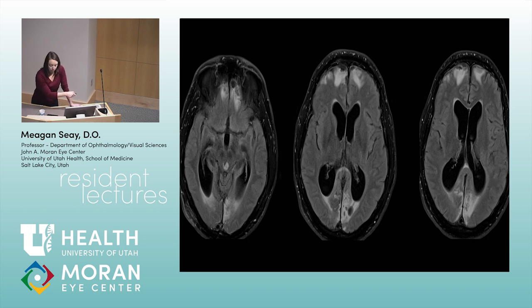Just to briefly review, the most posterior part of the occipital lobes is your macula, your central vision. More anterior in the occipital lobes is the peripheral vision. So if you spare the poles of the occipital lobes, you have the potential to spare your macula, or your central vision, which is what he did. Among all the bad things, that was one of the better things that happened to him. You can see this is the contusion from his fall. The vision loss is all from back here.